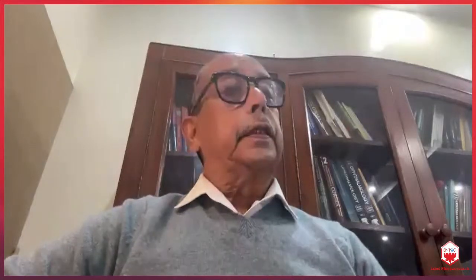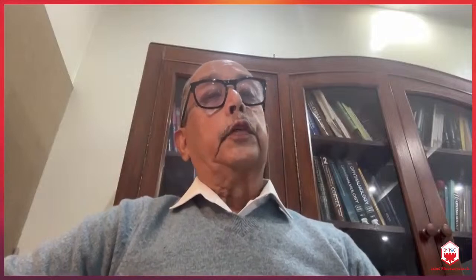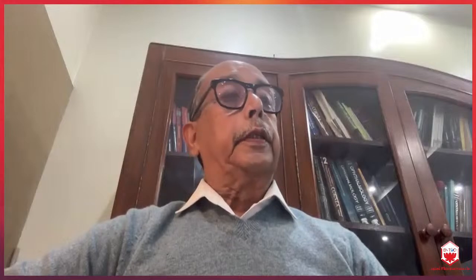The good aspect is, with a lot of hard work and extreme perseverance on this subject, we have come a long way, improved tremendously from the time of Sir Harold Ridley, who, in spite of successful historical implantation, landed up with minus 20 diopter spherical with minus 6 cylinder at 120 degrees of refractive surprise, to the present day of rare refractive surprises. Now, it is rare, but still it is there. Till date, we are in quest of an absolutely accurate instrument, formula or formulae to bank on to meet the assurance we give to our high-expecting patients.